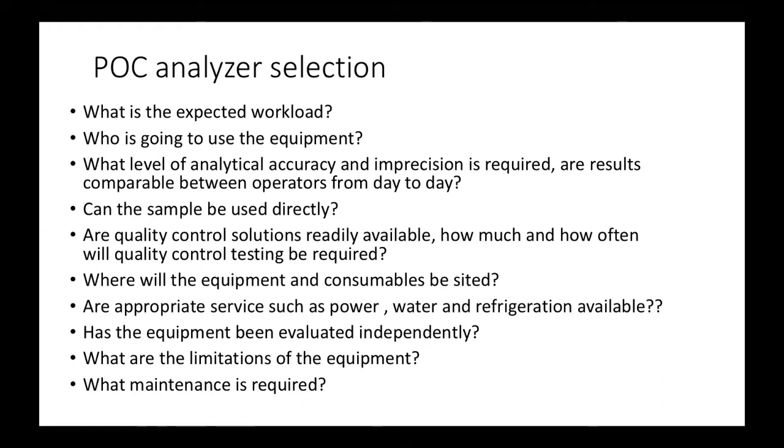And also evaluate this equipment and from time to time compare with the laboratory equipment, whether you are getting comparable results or not. You also have to understand the limitations of a particular equipment. And you shall have a system, as we perform maintenance of other equipment as per your clause 5.3.1.5, we have some system of maintenance in this point of care testing also.